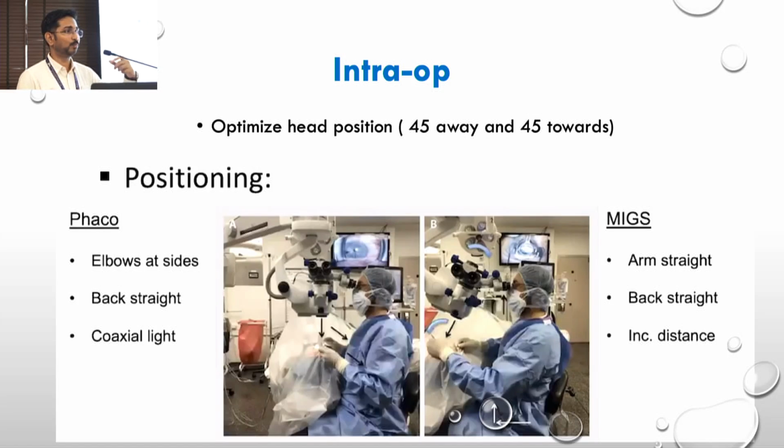And you don't want to put any pressure with your left hand or your right hand holding the gonio lens onto the cornea, which will create folds on the cornea and again impair your visualization. That is the major difference that you work with. And also, if you are not in a comfortable position or your instrument does not allow you to bend the microscope, like John said, you might be sitting at a lower level to watch the angle, and that would again be discomfort.